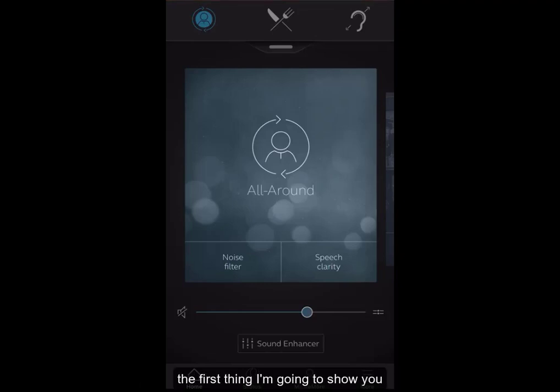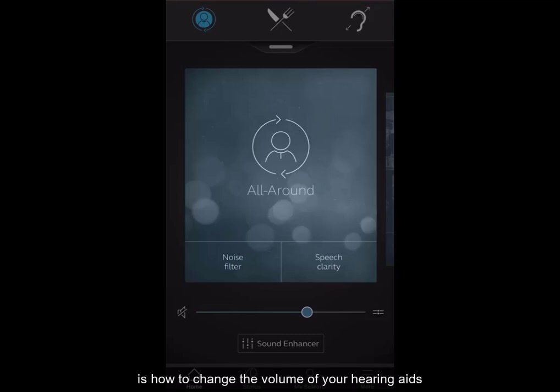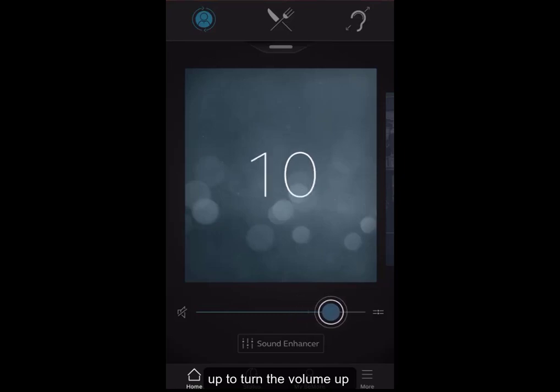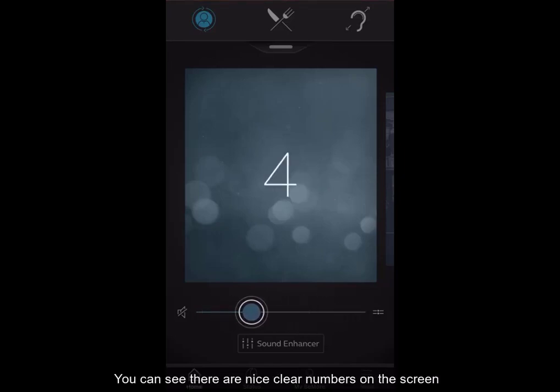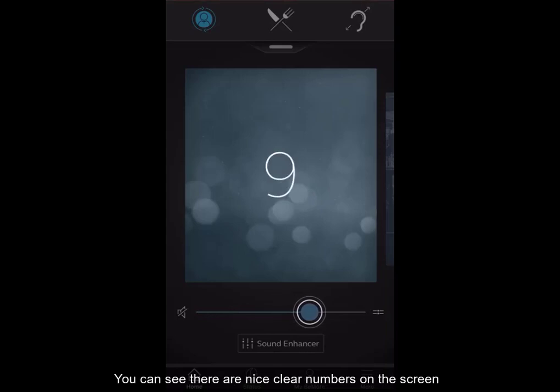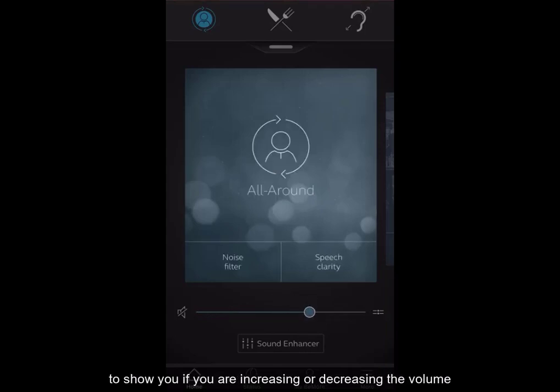The first thing I am going to show you is how to change the volume of your hearing aids. You simply move the blue button up to turn the volume up and down to turn the volume down. You can see there are nice clear numbers on the screen to show you whether you are increasing or decreasing the volume.